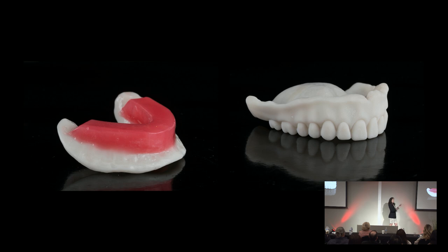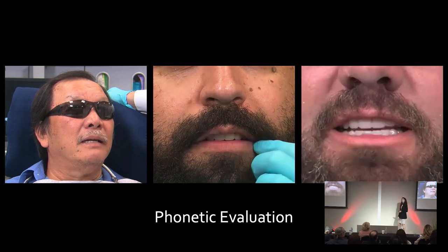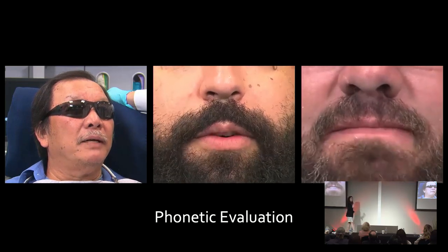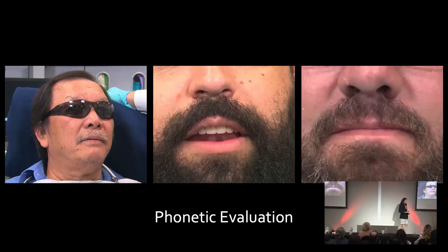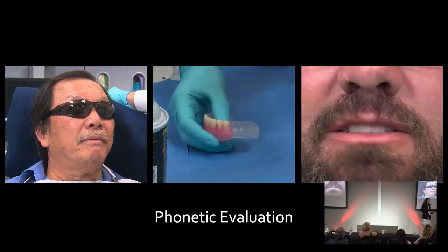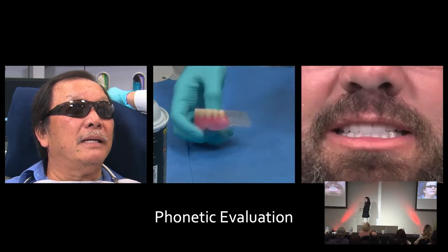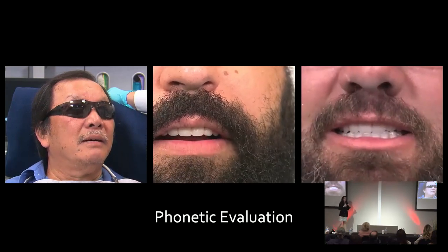Nowadays we can even give them a trial denture to wear in the digital world. You can hear them speaking. Dr. Swanson had a slide this morning about counting — I do this with all of my cases, dentures and full arch fixed. I want to test their phonetics. The two easy things I have them do: I count in the 50s — 50 to 60 — you assess their fricative sounds, which assesses the anterior tooth position. Then I have them go through the 60s through 70s, which helps assess that freeway space in the posterior.